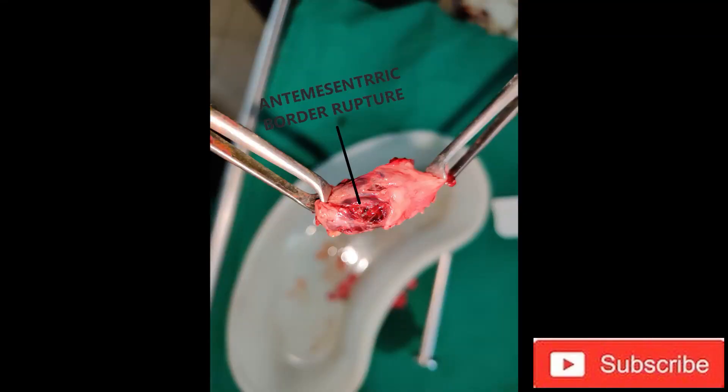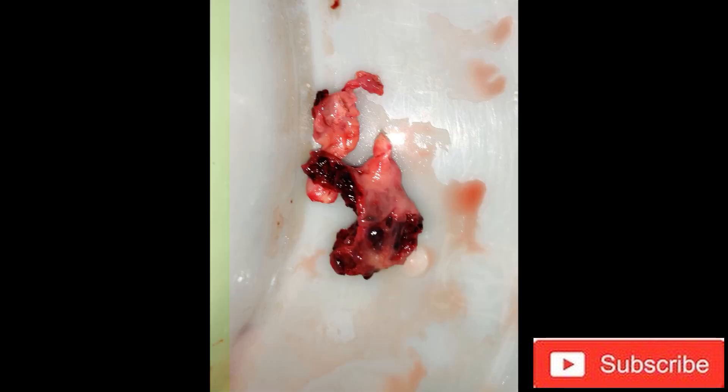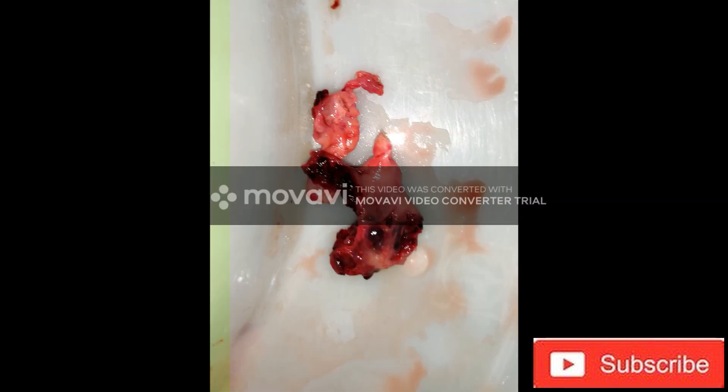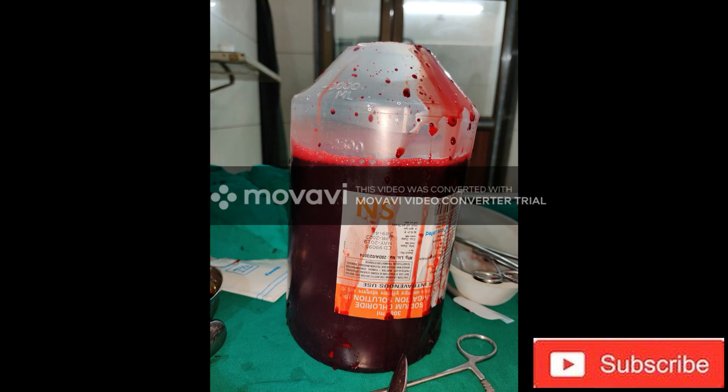Now you can see the anti-mesenteric border from where the rupture occurred, and this is the hole of the ectopic tissue. The total blood loss was around 2500 ml, from which 500 ml was removed intraoperatively, so the net blood loss was approximately 2000 ml.